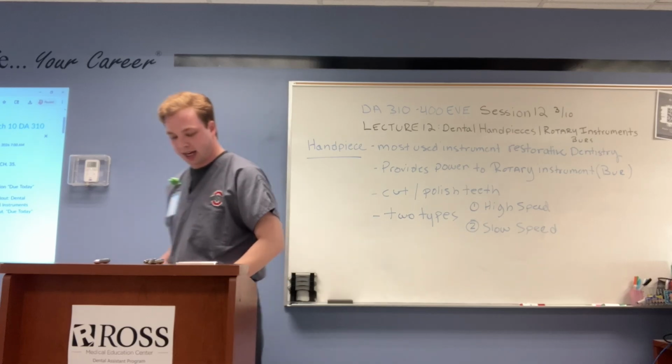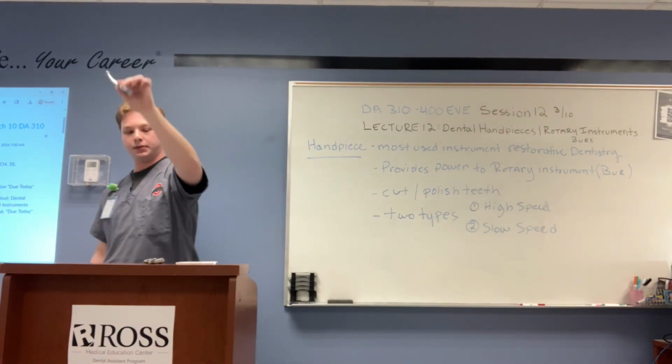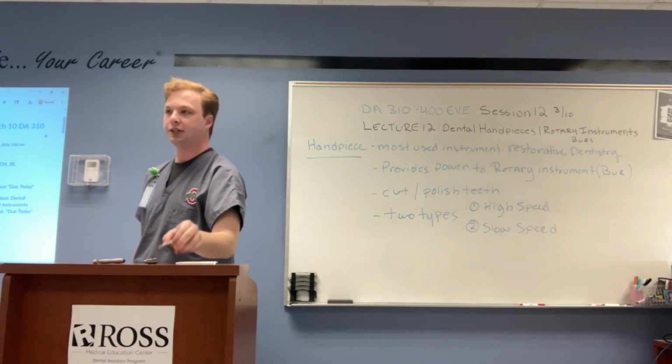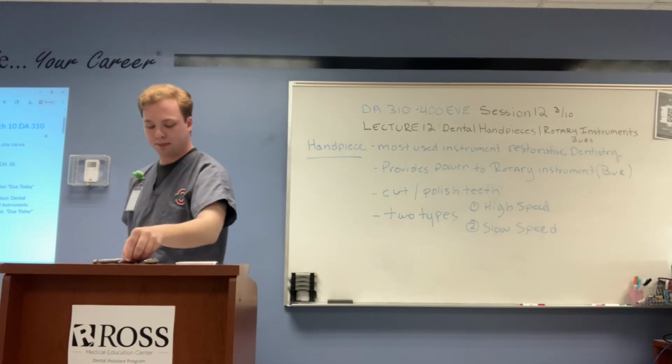The high-speed handpiece is the one that looks like this in one unit. The slow-speed or hygiene handpiece has different attachments on it.